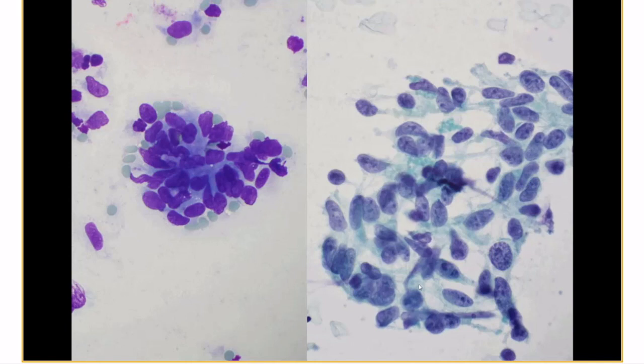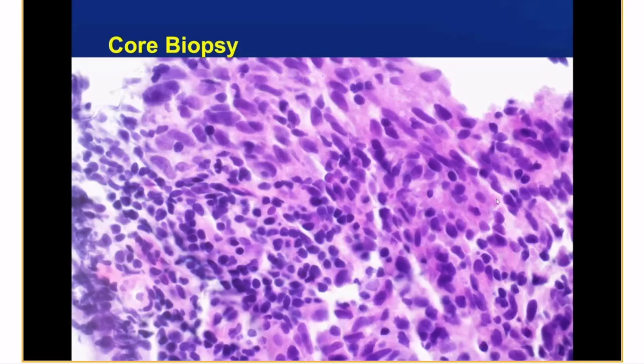So you can see on the Diff-Quik stain the cells are high-grade, pleomorphic, basaloid with scant cytoplasm, and on the Papanicolaou stain they have very coarse chromatin, somewhat molding, different kinds of shapes, pointy edges, and scant cytoplasm. On the core biopsy, here you see again the neoplasm, very pleomorphic basaloid with some admixed lymphoid cells.